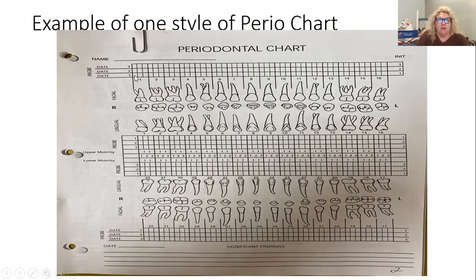And so the hygienist or the doctor is going to call out the missing teeth. We always want to chart the missing teeth first. So you would put an X through the tooth, and then you're going to X out this box for tooth number 1. Then we're also going to come down here to the lingual for tooth number 1 and mark out this box, because we don't want those numbers in that box either. So you have to mark out all the missing teeth first. Remember, when you mark out the tooth, you're going to do buccal or facial, and then the lingual boxes as well. So each tooth should have 2 sets of boxes that you're going to mark out. Okay, so be sure to do that.